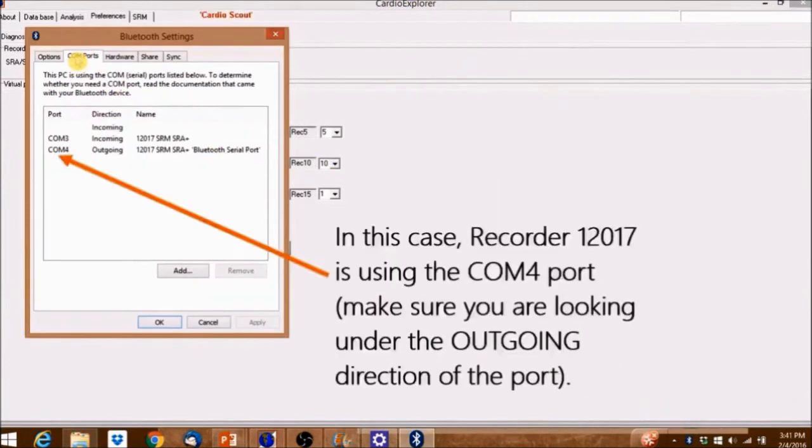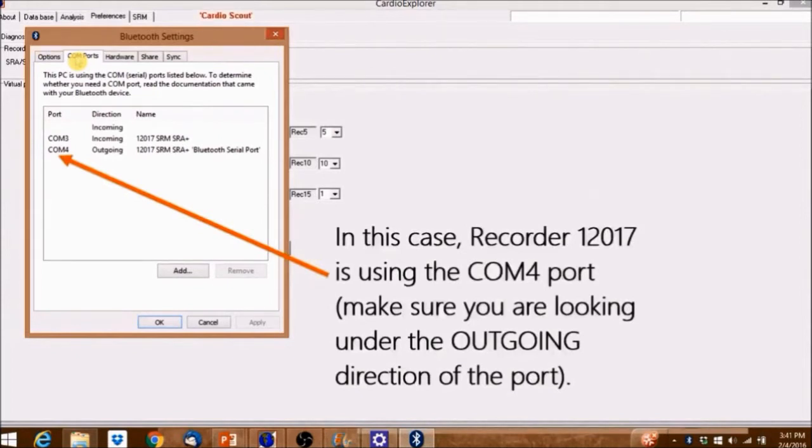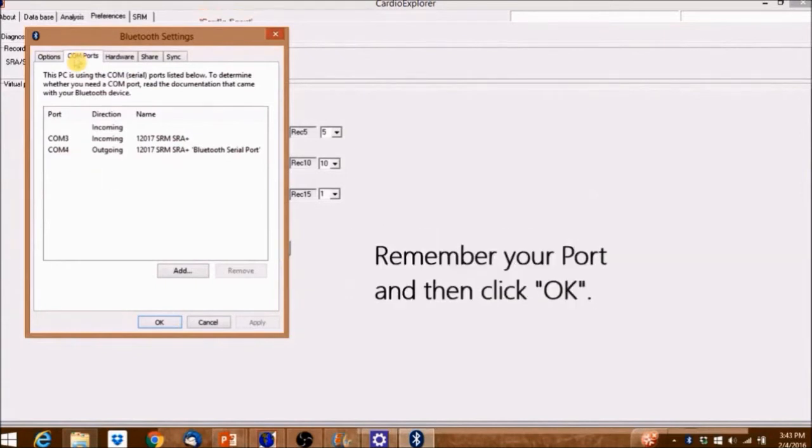In this case, Recorder 12017 is using the COM 4 port. Make sure that you're looking under the outgoing direction of the port. Remember your port and then click OK.